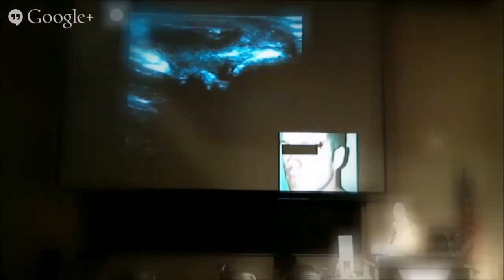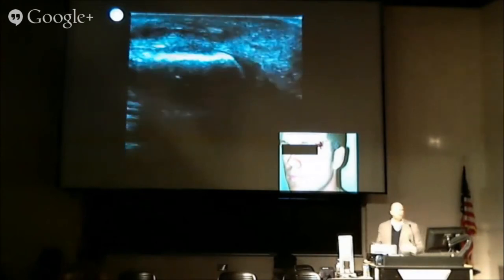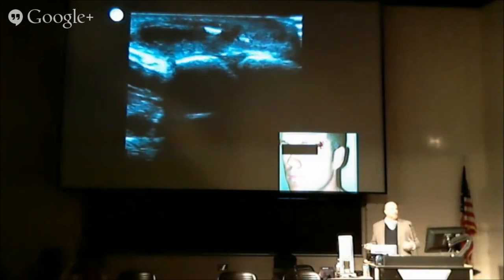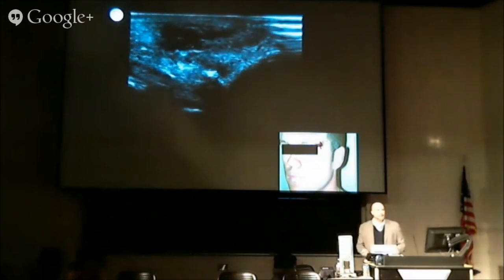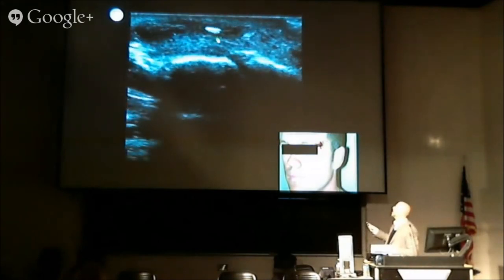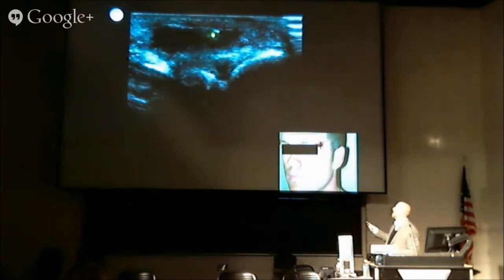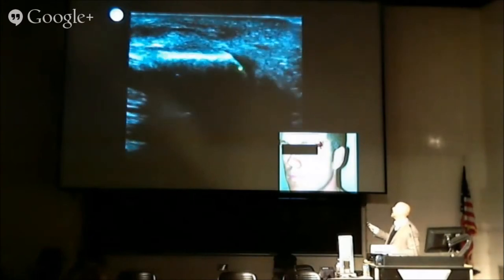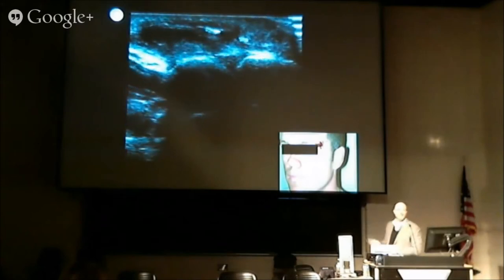So here's this guy here, right? I saw probably 300 foreign bodies in a period of a year. Most of them are blast. You can push on, and then what are you supposed to say? Well, it hurts when I push there. Well, sure it does. You got shot. You had an RPG go off. But with ultrasound, you can look, and you can tell them exactly where the foreign body is. And you can see, this is a hand foreign body. You can see if it's in the actual joint or if it's not in the joint. You can see if it's in the tendon or not.